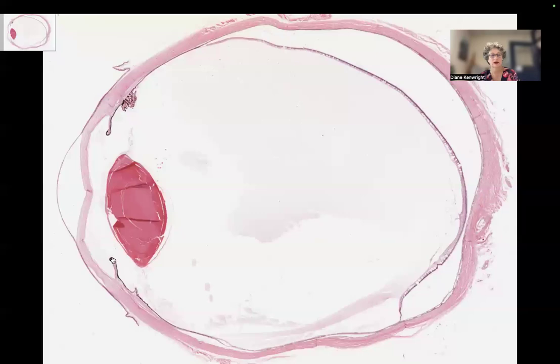is an ectropion uvei. So this is a bit of pigment epithelium from the back of the iris being pulled forward to the anterior part of the iris due to contraction of a vascular membrane here. The irises are also quite flat. Normally, we would expect the iris root to be about here, so all this is adherent. The lens looks pretty okay.